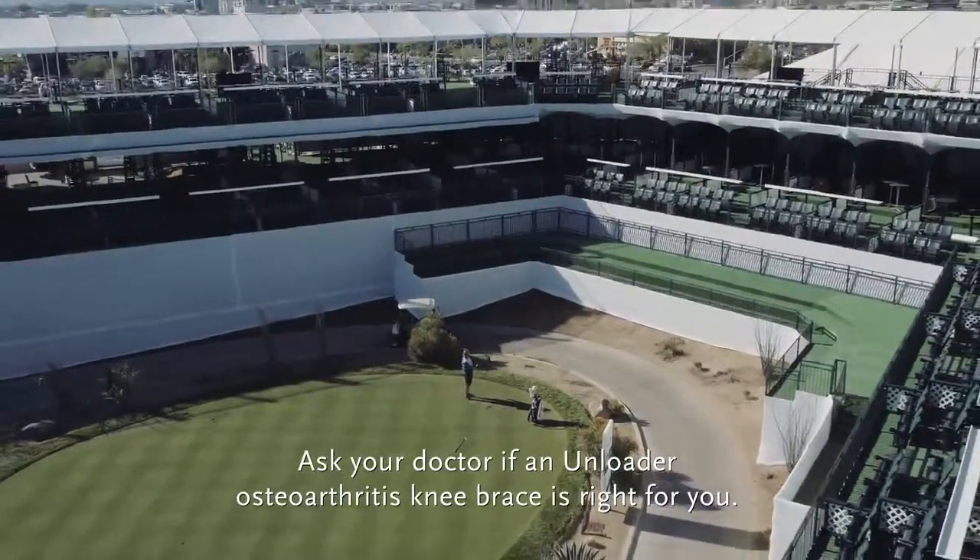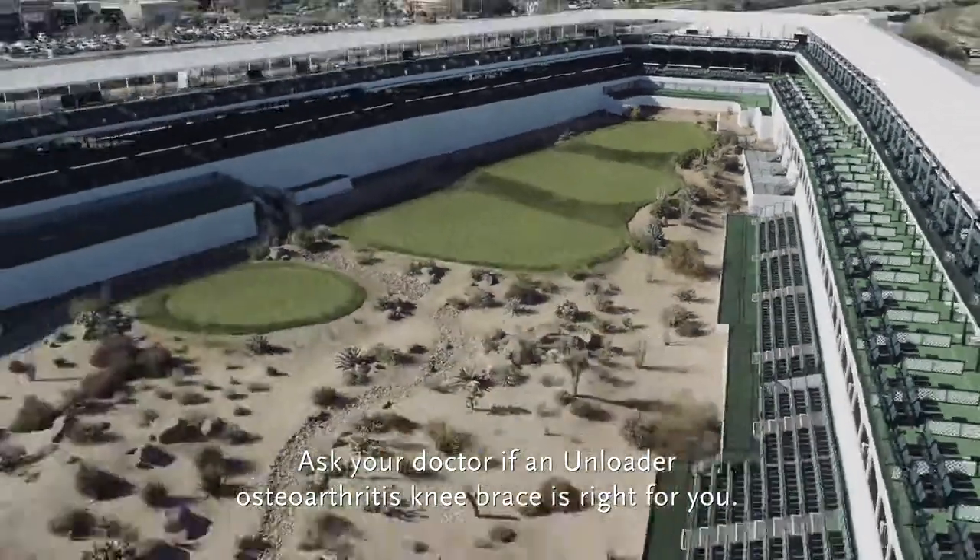Ask your doctor if an Unloader osteoarthritis knee brace is right for you.